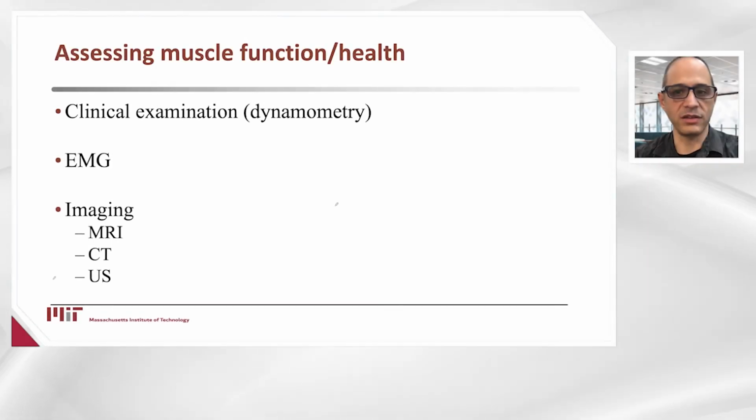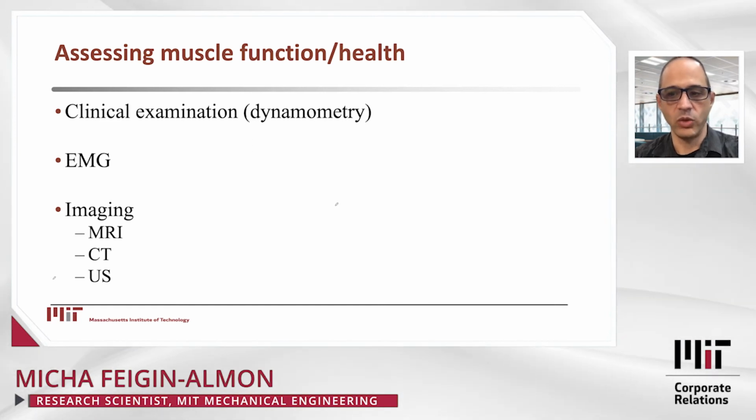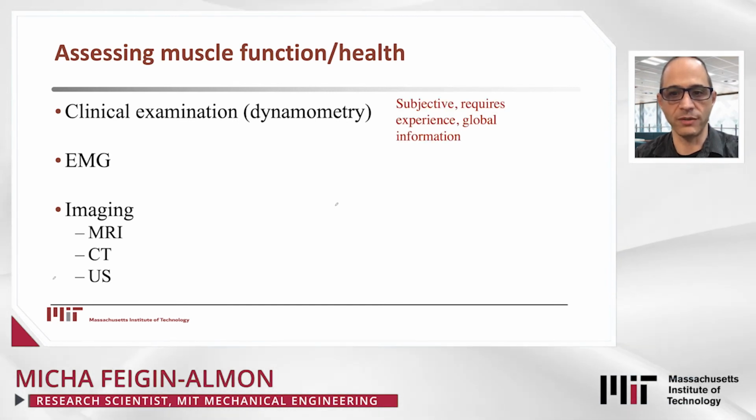The proposed technology is the first step for developing wearable devices for in-home diagnostics and feedback, giving a more objective presentation than clinical visits. To date, there are no good ways of getting a cross-sectional muscle functional or health during motion. The first line of diagnostics is clinical examination, where the physician will perform palpation and work with the patient with or without resistance through the motion.